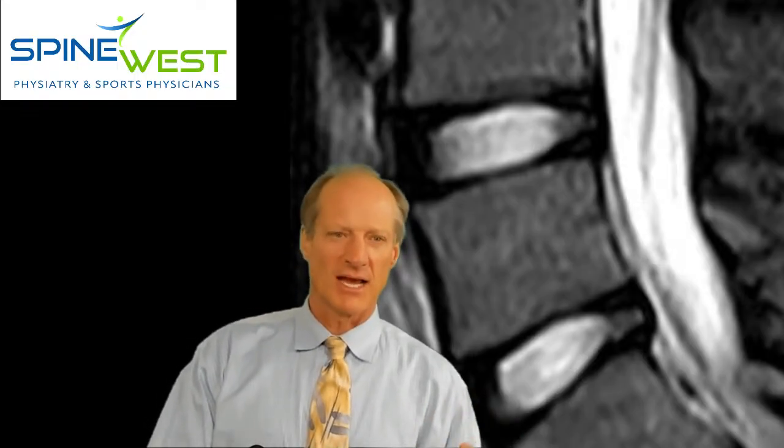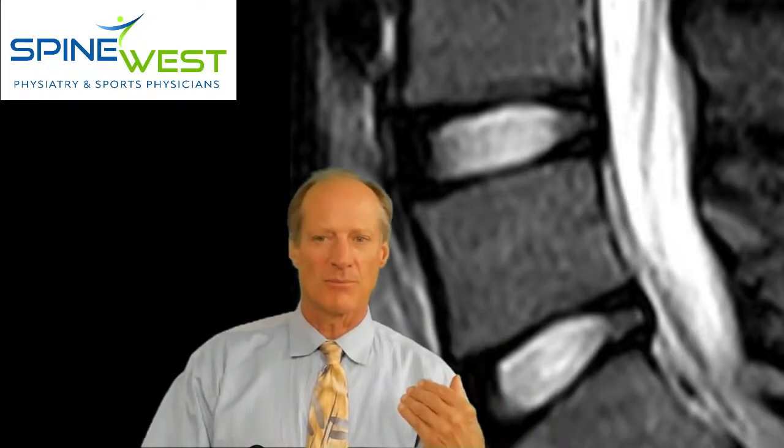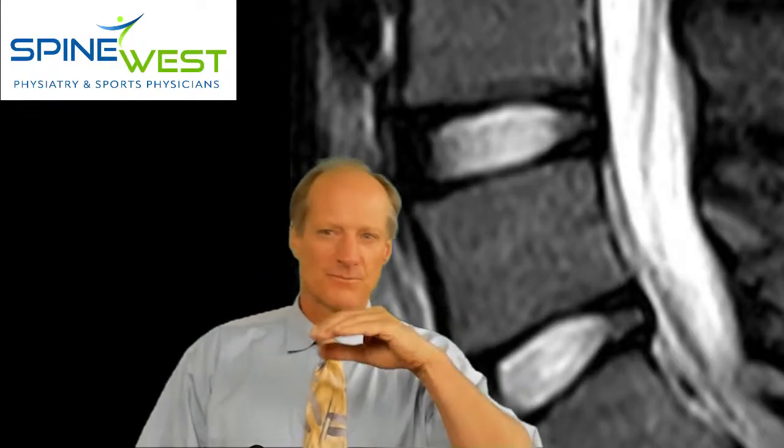The other modalities you have include ultrasound, which is simply sound waves that go into the body and reflect back, showing different layers. Just like you'd see a geologic seismograph or some kind of cross-section of a geology structure, you see layers that are reflected back up to the probe, and it shows the layers of the skin.